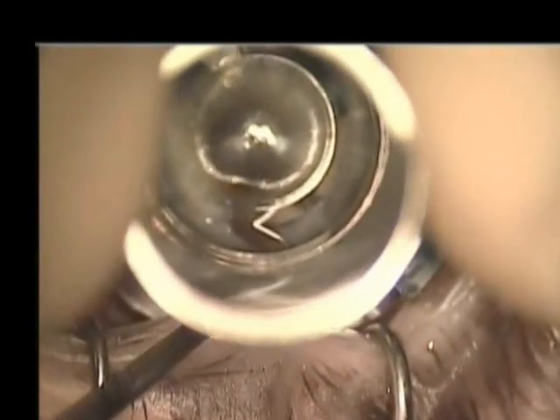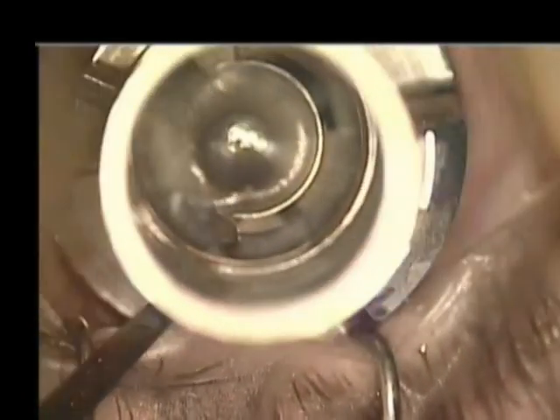The channel creators are inserted below the largest lamellar dissector and then rotated for approximately 180 degrees. The same process is done with the superior channel.